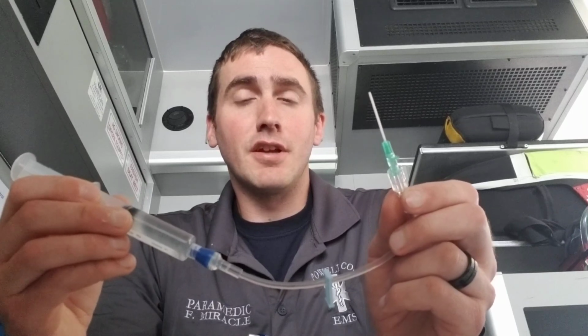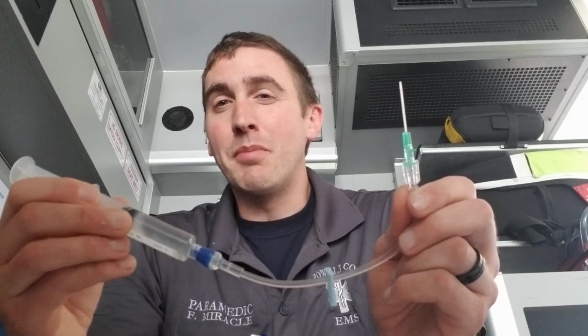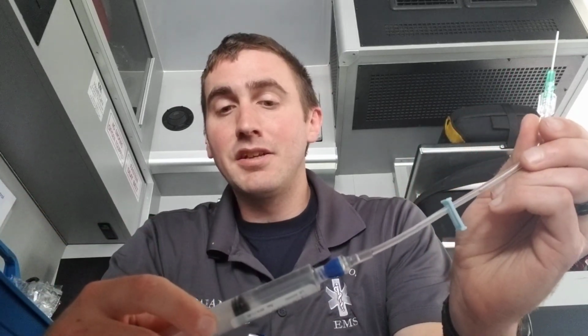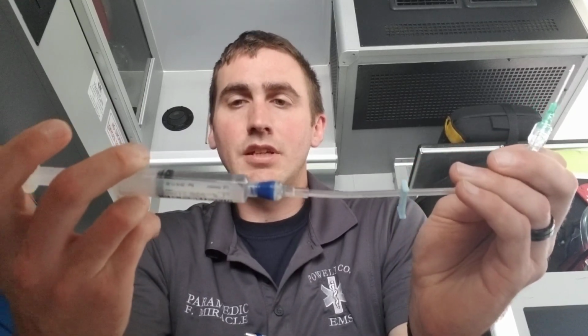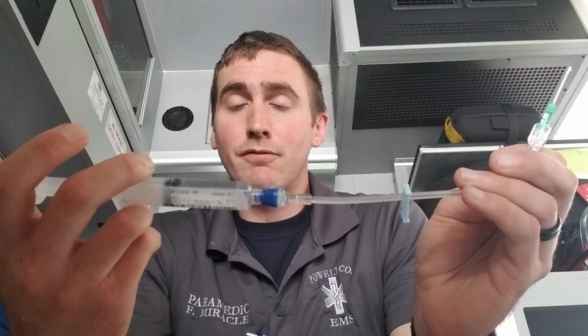This also applies in other areas, such as if you have a medication that you want to give slow, like ketamine. You want to give ketamine over about 10 to 15 minutes, and ideally you would do that by mixing your ketamine in a 100 cc bag and delivering it slow. But let's say that you don't mix it in 100 cc bags and you just give it slow IV push like this. So we're giving this slowly. We're trying to give it over about 10 to 15 minutes so that the patient doesn't have any severe side effects from it.